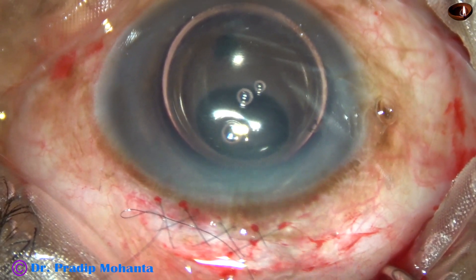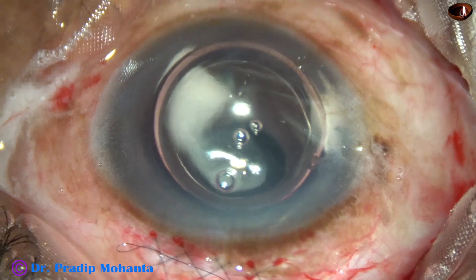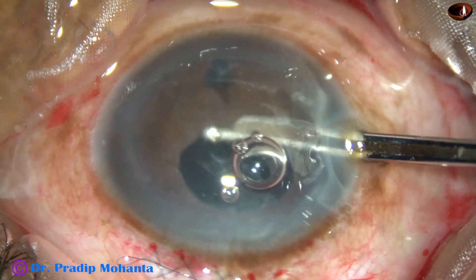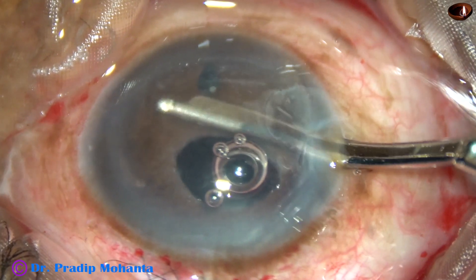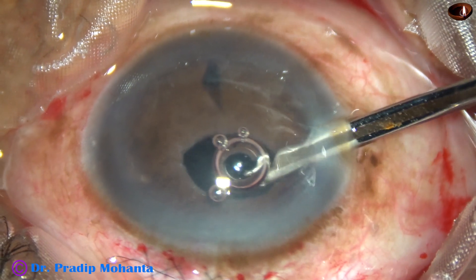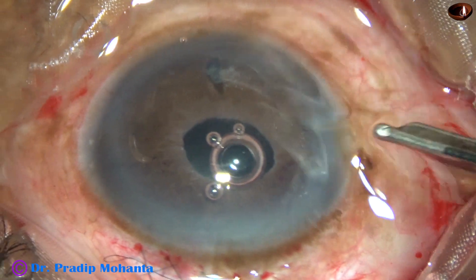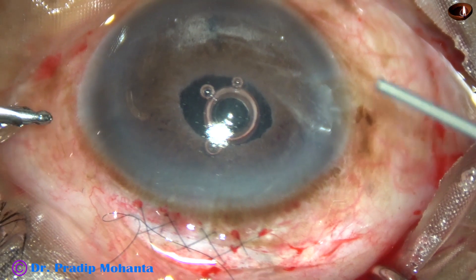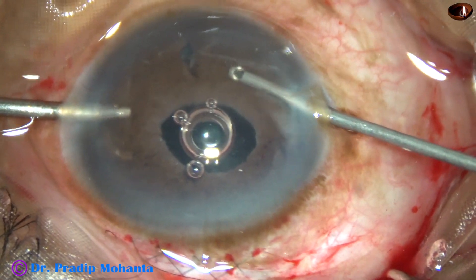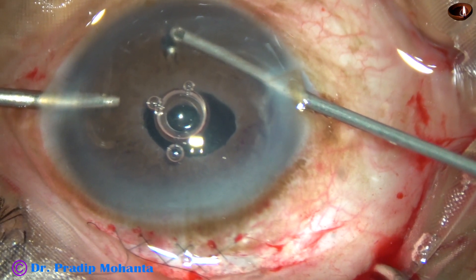Now I inject air and then inject triamcinolone acetonide to check if there is any vitreous, and this will reduce inflammation very nicely. And now I remove the triamcinolone acetonide. There is no vitreous in the anterior chamber, but a lot of triamcinolone acetonide has gone behind the iris into the vitreous through the PI. Here I removed some more iris tissue so that the PI remains patent.